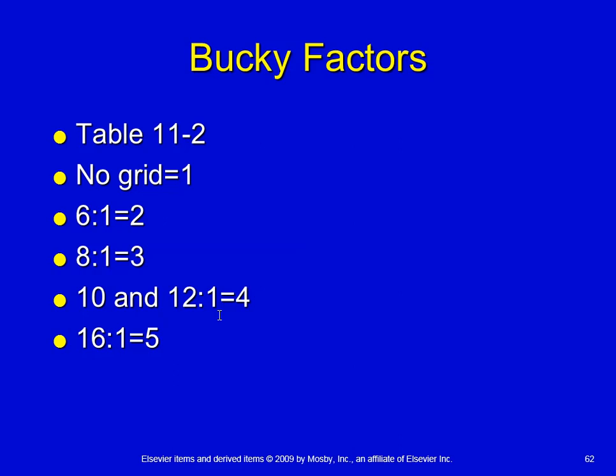So generally, whenever you're shooting a KUB for an NG tube, you don't really shoot a KUB. You shoot like a low chest X-ray or a high abdomen. So the top of the image receptor would be up around the right mainstem bronchus. So that if you didn't see the NG tube on the KUB, you might be able to see where it is. Is it still in the esophagus?